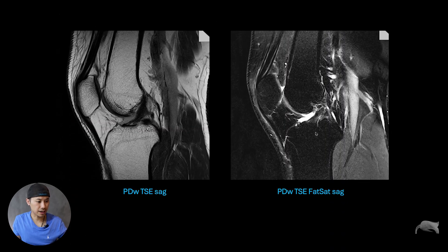This is PD weighted and fat sat as well. It's very easy to spot on the fat sat sequence right here — some of the more fat saturation and the noise. And nonetheless, it was the coil. So we did a quality assurance and it was the coil element which was faulty. So yeah, we had to order a new one.